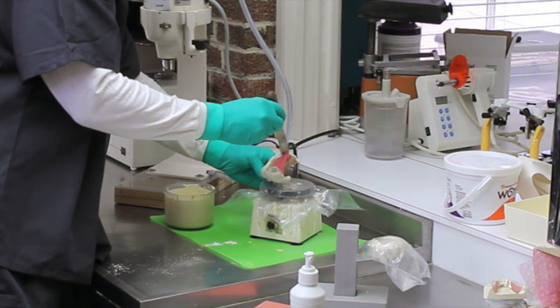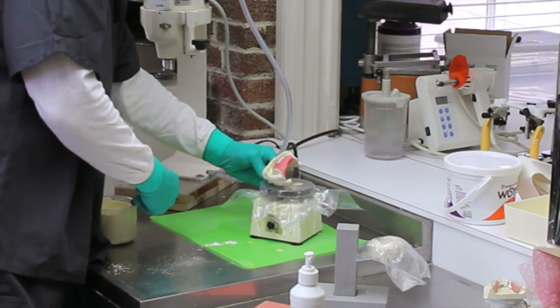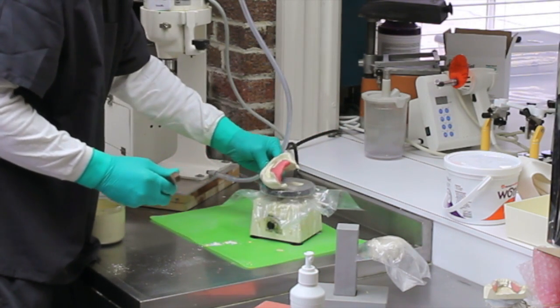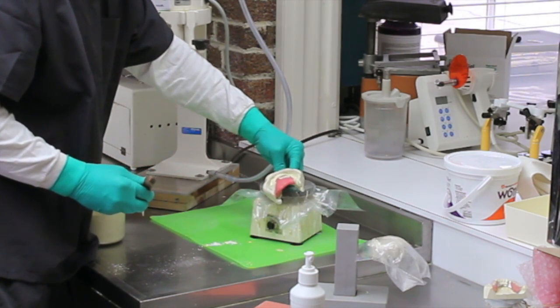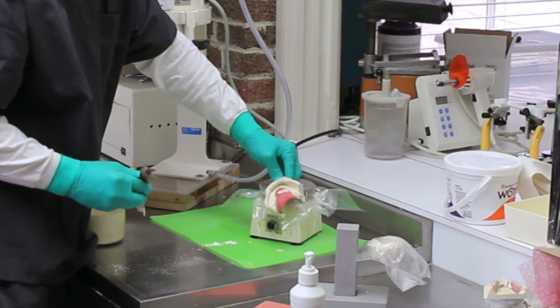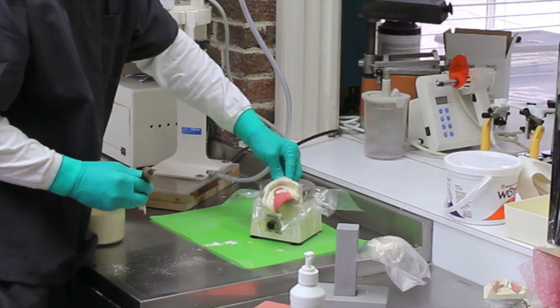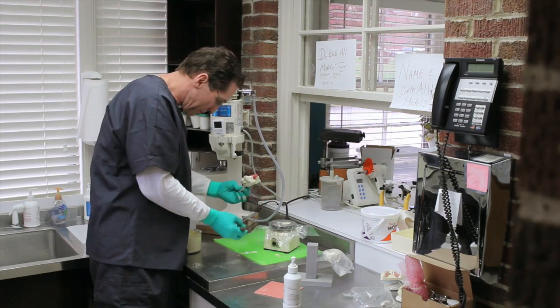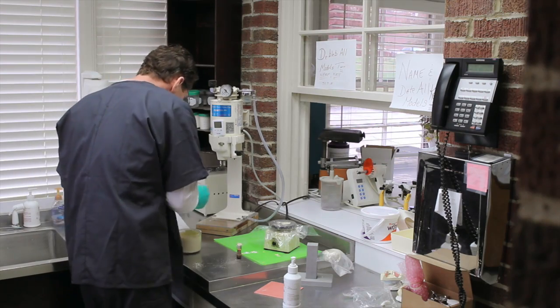And as it does so, we will see that it will create a little pool of that debubbleizer that we sprayed in. We don't want to incorporate that into the stone mixture. And as you will see, as it comes off the end here, you'll see a little bit probably drip off there. A little bit of that excess dripped off right there. Okay, once we have that, now we're going to go finish pouring.